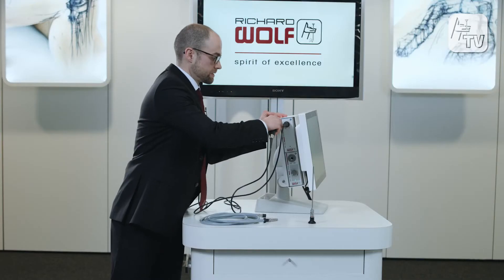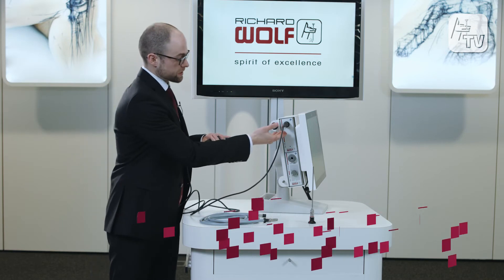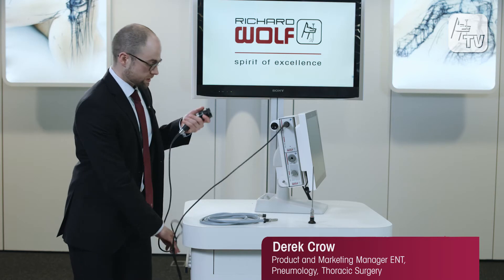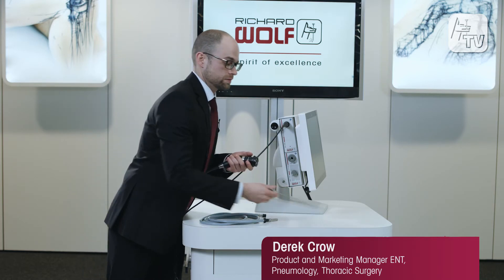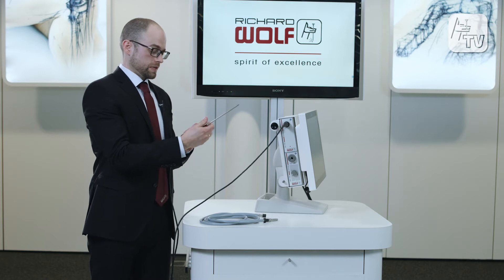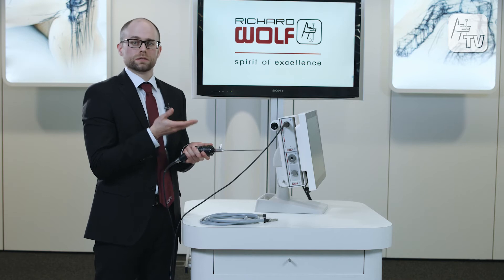The single chip HD camera head simply plugs into the unit here, as we can see. To this I attach my rigid endoscope. The camera head is designed to fit any existing endoscope — it works universally.